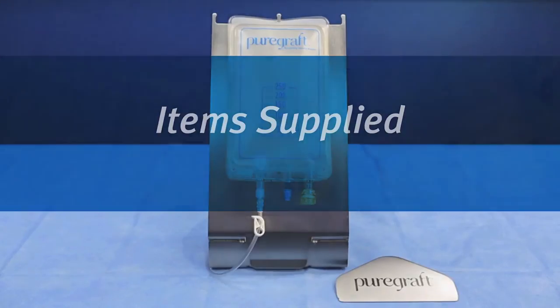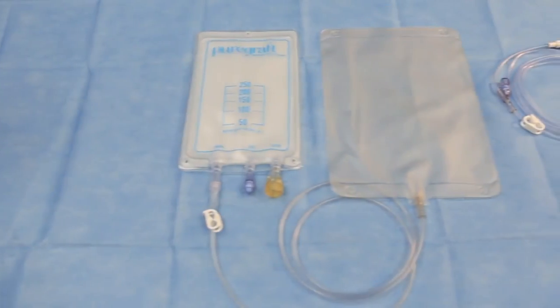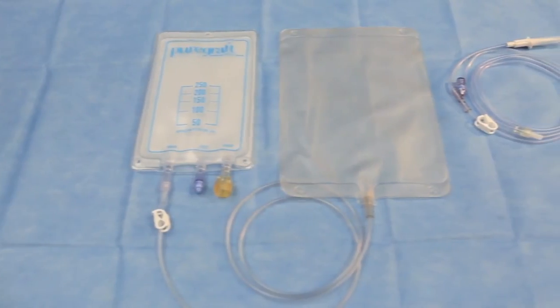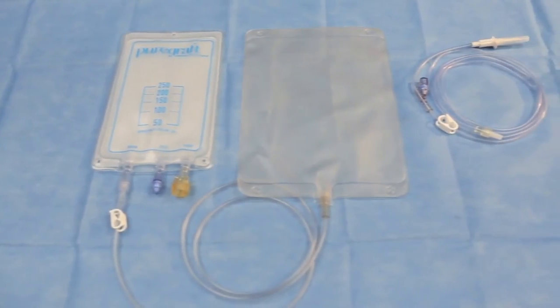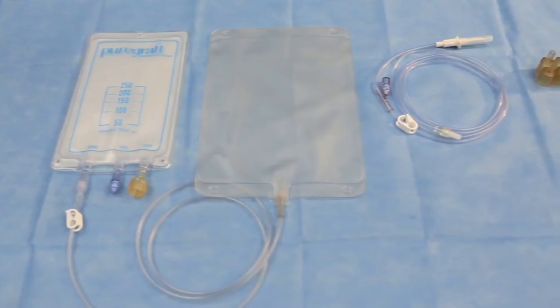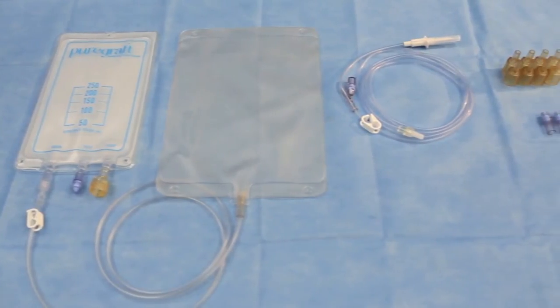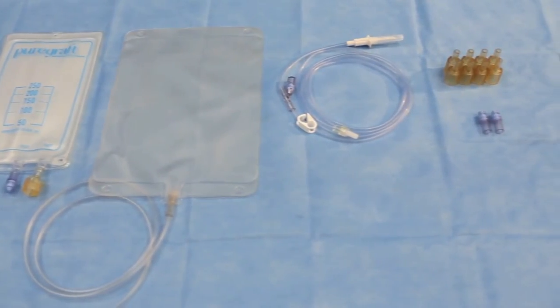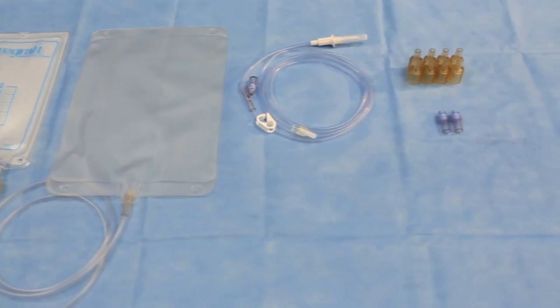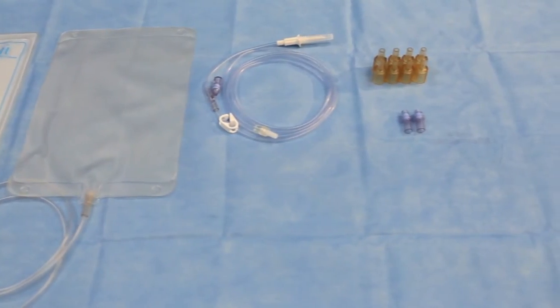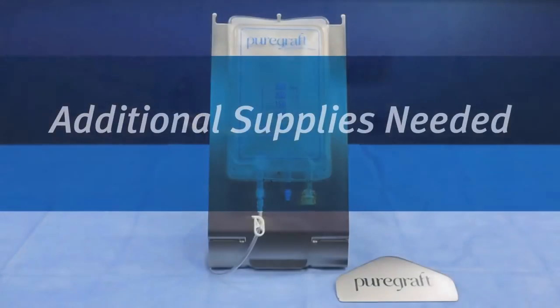The PureGraft 250 system contains the PureGraft 250 bag, a 1.5 liter drain bag, an inlet tubing set to add the washing solution, eight tissue access port adapters, also known as tappers, for tissue insertion, and two tapper to luer adapters.